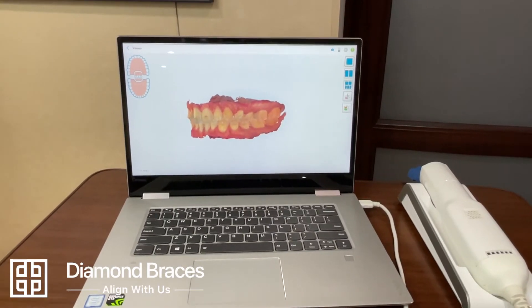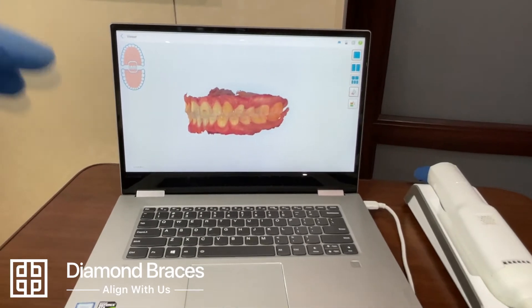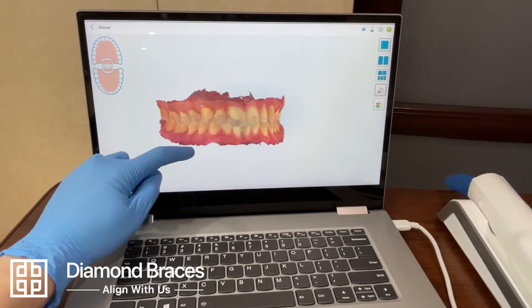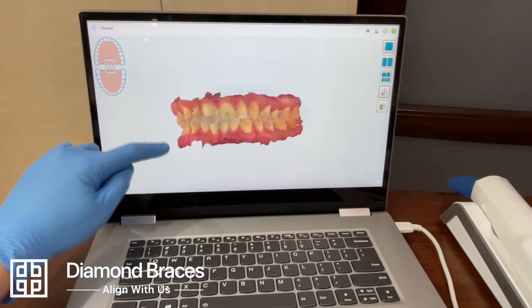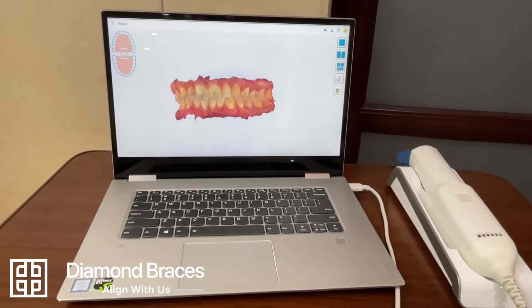To make your night guard, we will use the most advanced digital technology to take a high-quality 3D scan of your teeth. This scan records the most accurate position of your teeth, allowing us to make the highest quality night guard possible. This also means a fast, easy, and comfortable experience for you.